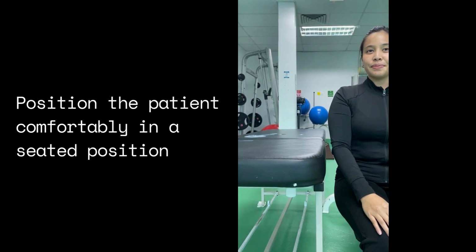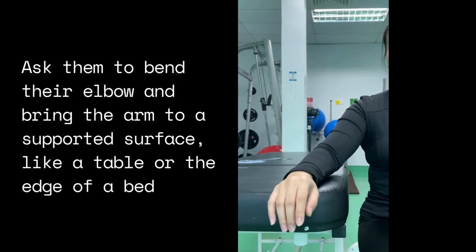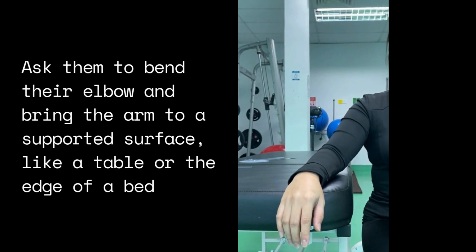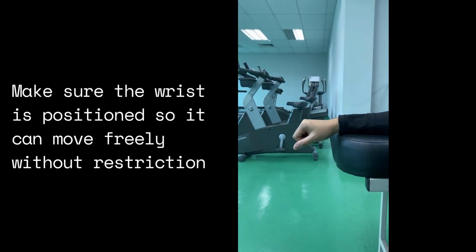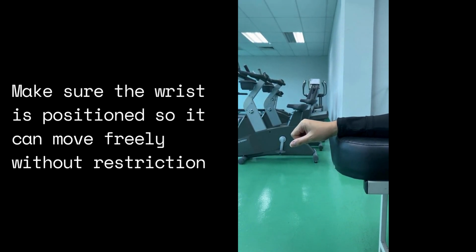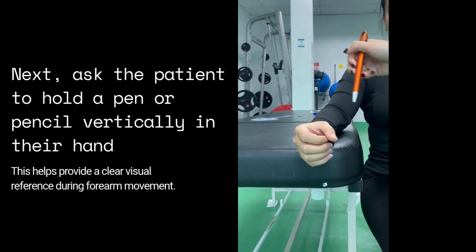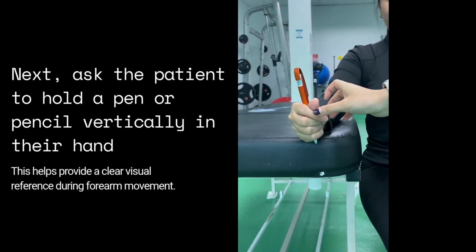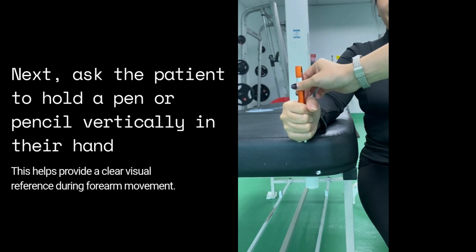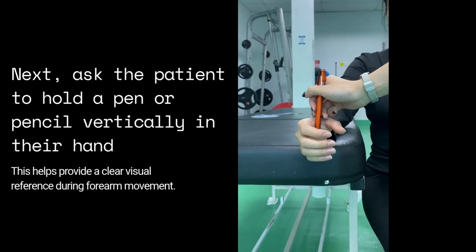First, position the patient comfortably in a seated position. Ask them to bend their elbow and bring the arm to a supported surface, like a table or the edge of a bed. Make sure the wrist is positioned so it can move freely without restriction. Next, ask the patient to hold a pen or pencil vertically in their hand. This helps provide a clear visual reference during forearm movement.